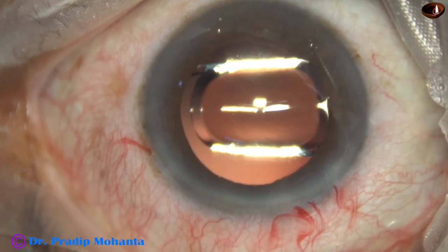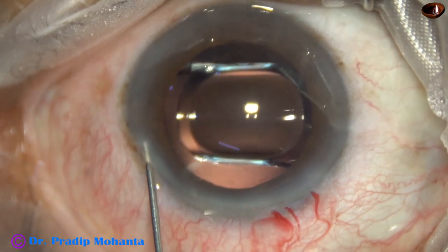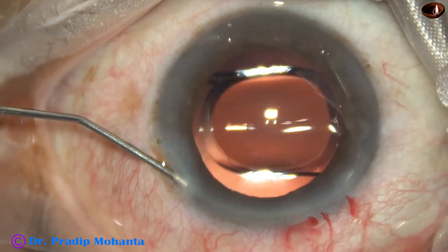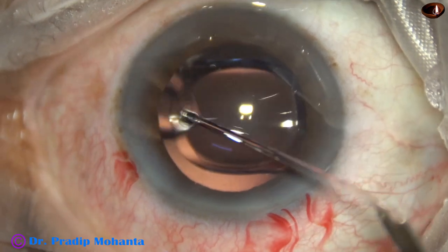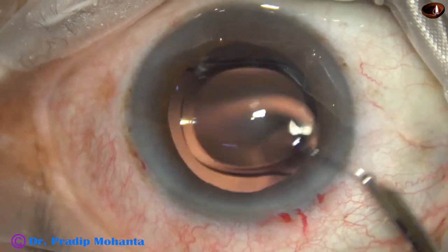This is moxifloxacin. The side port is closed by stromal hydration. The stroma is hydrated by BSS, and then a final lavage of the anterior chamber.